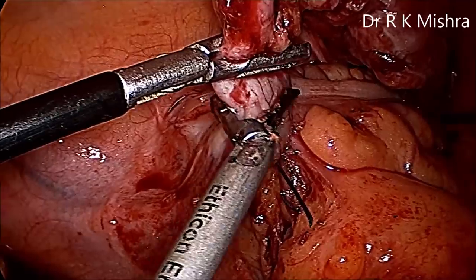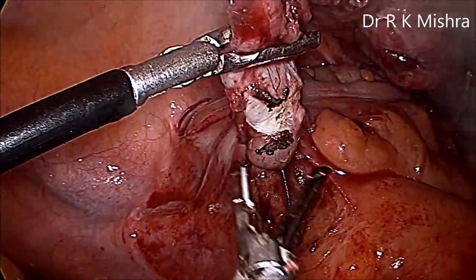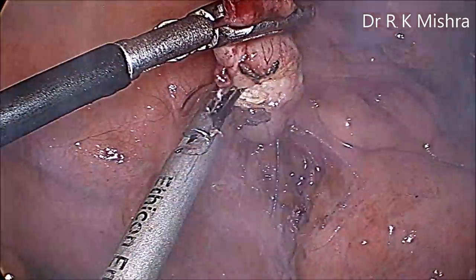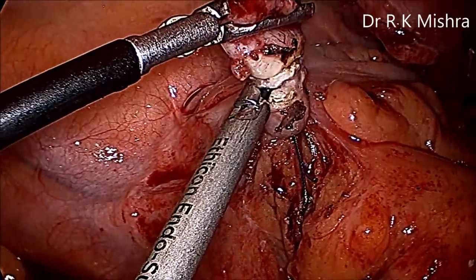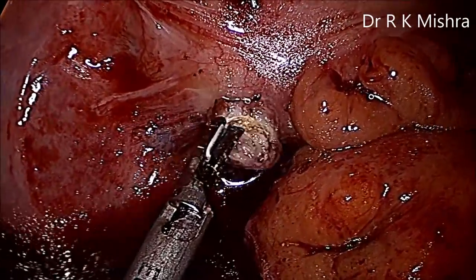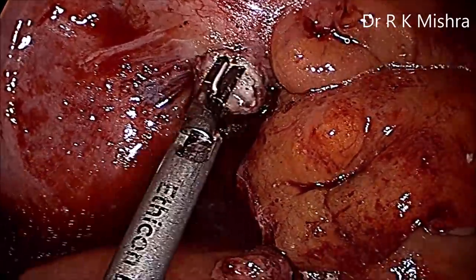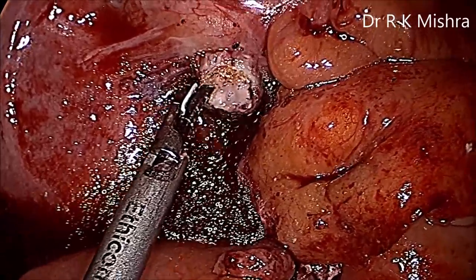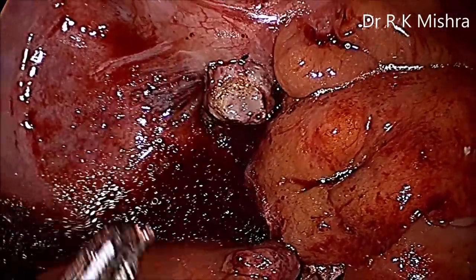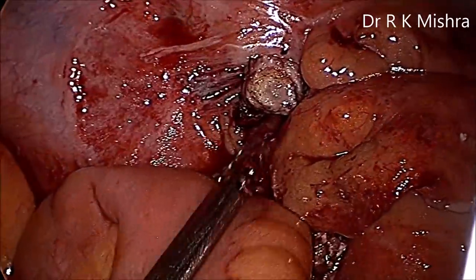The advantage of cutting with the harmonic is that the mucosa will burn and the fecal matter gets disinfected, so there will be no chance of a mucocele of the appendix. So a 5 millimeter stump is left, and now the appendix is transected from the base. After that we are just touching the remaining mucosa with the tip of the harmonic so that it will burn, and it is over. After that, you can put in suction to take the fluid out over this fossa. This is minimal fluid, and the bleeding is very minimal, maximum 2 ml.